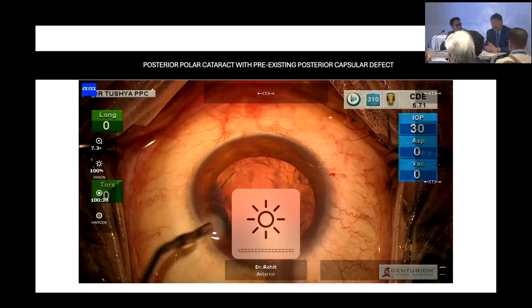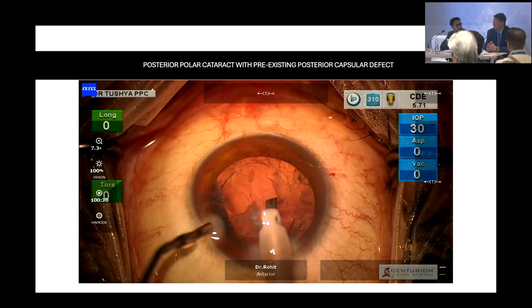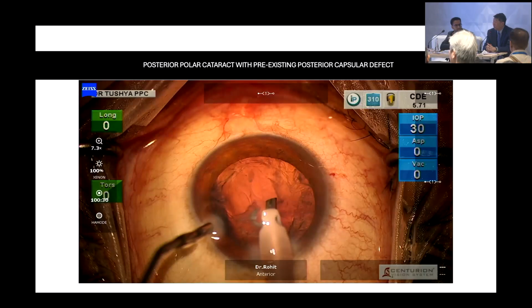In the United States, if you had a polar and you know in advance that the patient may have a PCR, we will tell them about the light adjustable lens where we can put that in and treat anything. And if you really needed like a T7 or a high power, you could do reverse optic capture.